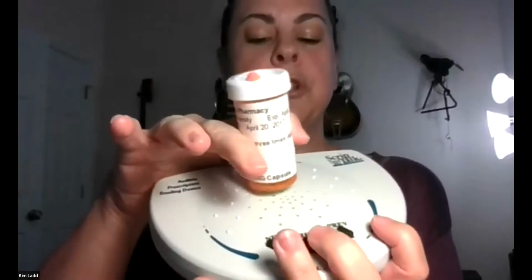What happens is you get your medications from the pharmacy and they're going to put a special sticker on it. It's an RFID sticker, which is radio frequency ID, that works with this machine. They usually put it on the bottom of the prescription bottle. When you get your prescription, you want to place it near those bump dots on the face of the machine. Then that oblong button that I talked about, that's the read button. That's the button that you want to push. I'm going to place the bottle on it and then push the button and let you hear what kind of information this system will give you.